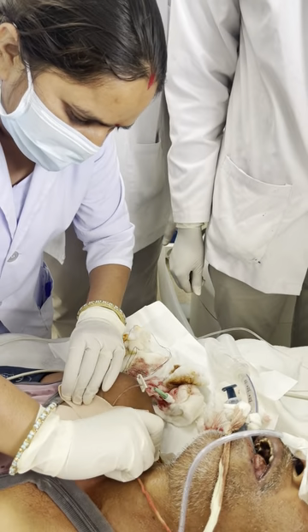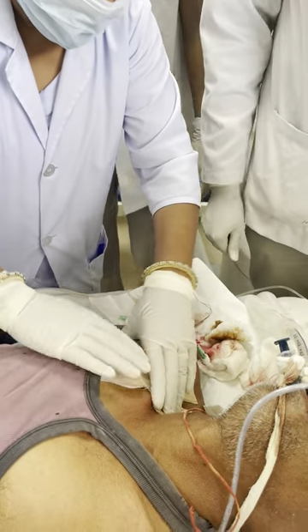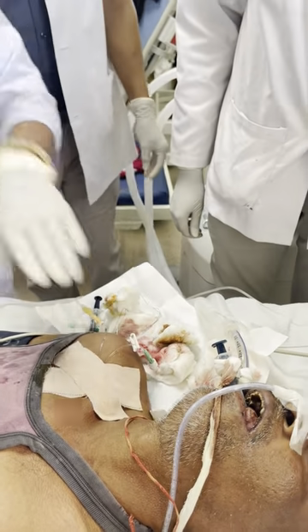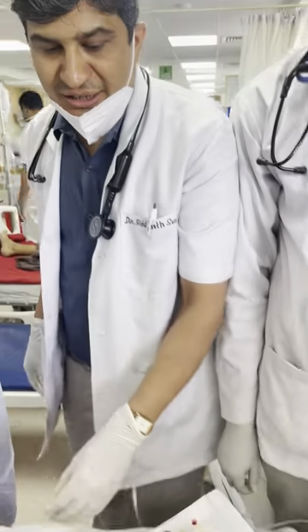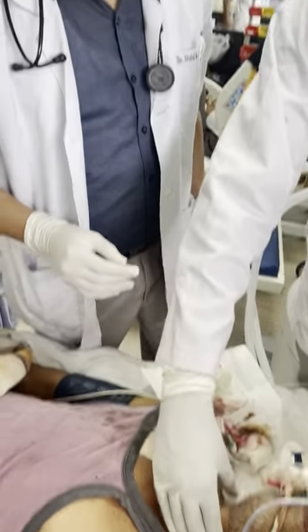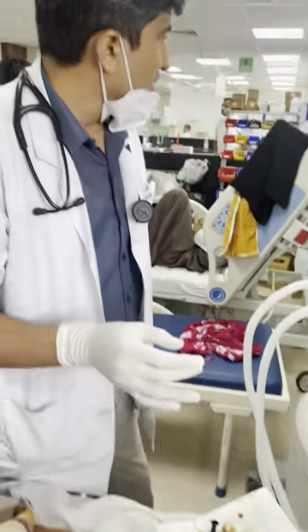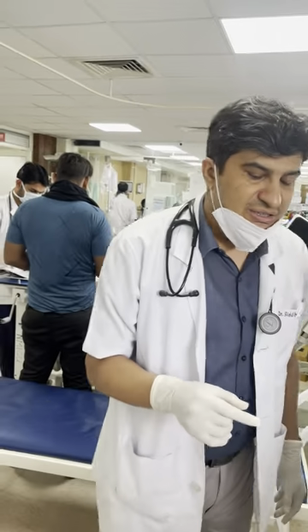So always keep an eye over the patient also while doing this. Since you are doing this first time, like pulse, all those parameters, the patient is alive or not during the procedure. Okay? That is the most important. See the pulse? Before doing pleural tap, ascitic tap, central line, any procedure you are doing, you have to keep an eye over the patient. Okay?